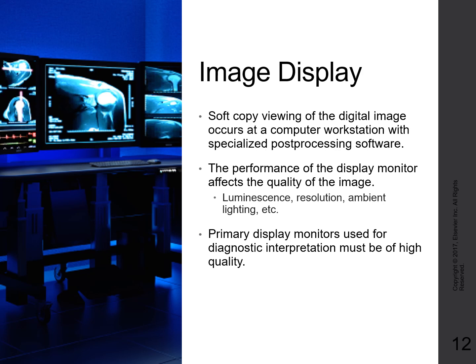Now, when we look at our image display, I'll tell you that radiology education has changed considerably in the last 20 years in this area of study. Originally we used to have to know everything about film, how it was processed, all the chemical reactions within those processing systems. But now they have removed that information from the boards, and we're concentrating more on just the digital display.